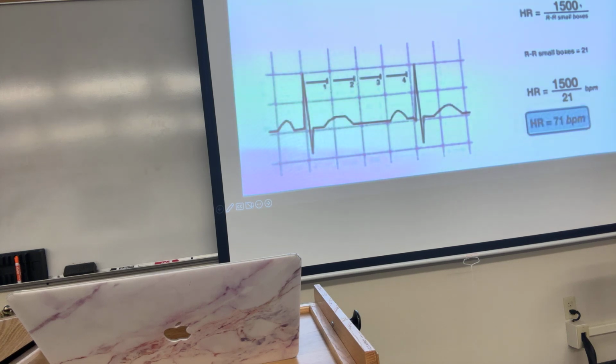So 5 of the large ones would be like 1 second. So 5 of these? Yes. Like 1, 2, 3, 4. And 5 would be 1 second. Yes, because they're 60 beats per minute. Yes. So 1 beat per second.